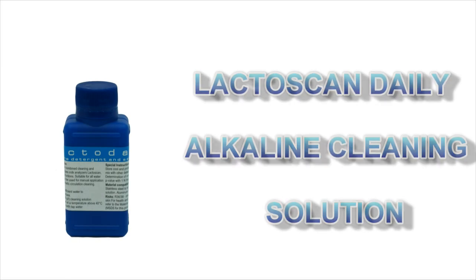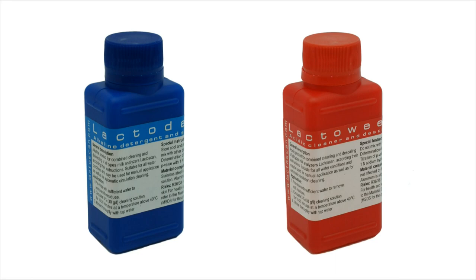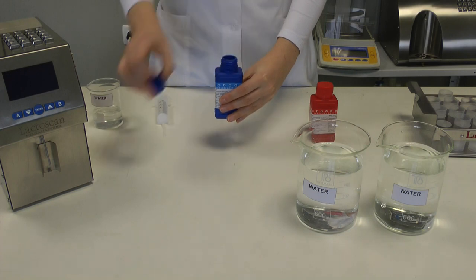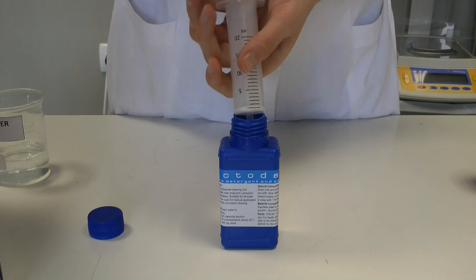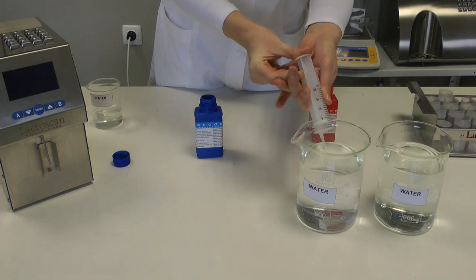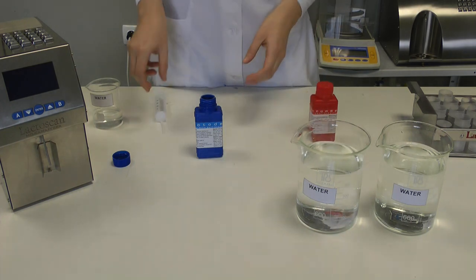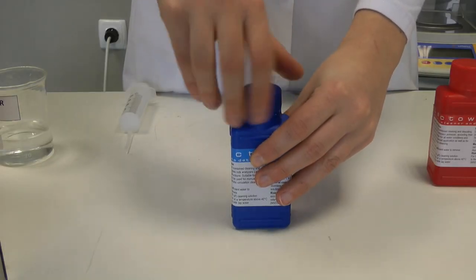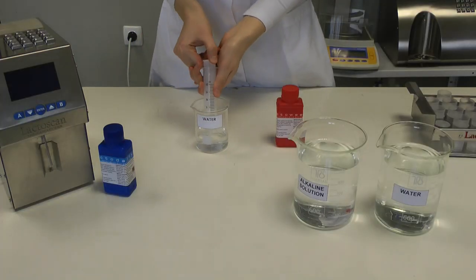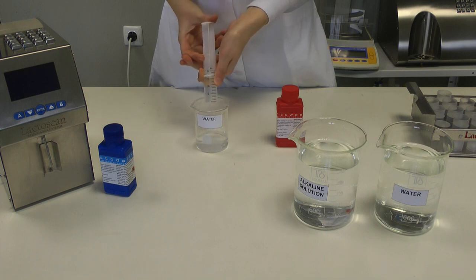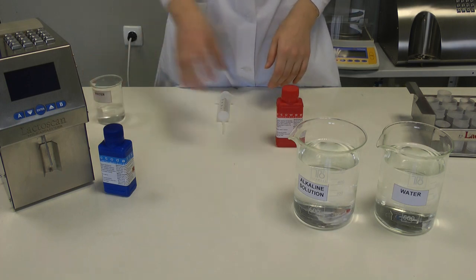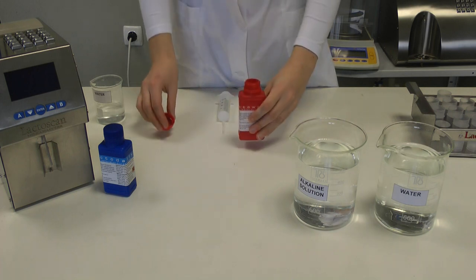We recommend usage of the chemicals supplied with the analyzer, alkaline and acidic, lactodaily and lacto-weekly. They may be ordered together with the analyzer. Preparation of the analyzer. Preparation of 3% working solution. Preparation of 7% working solution. Repeat the same with concentrated acidic solution.